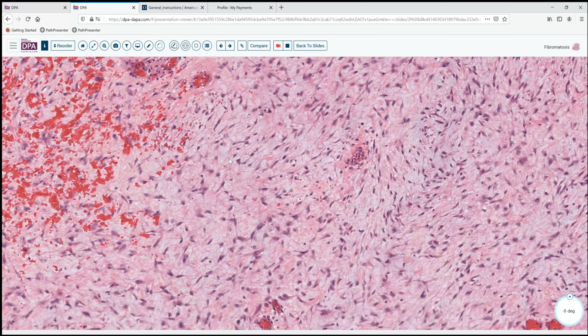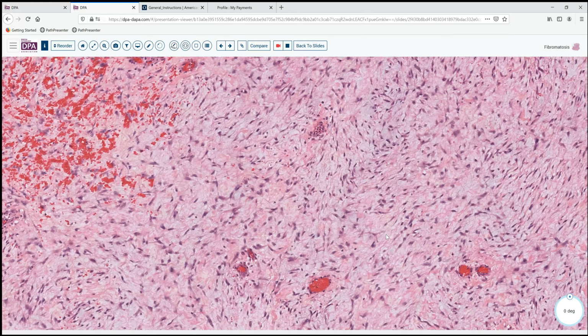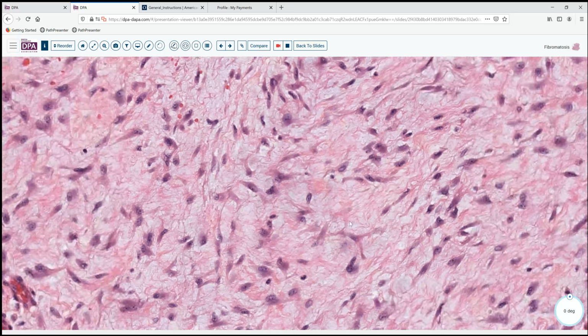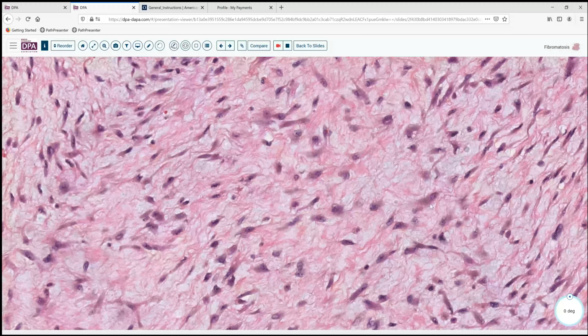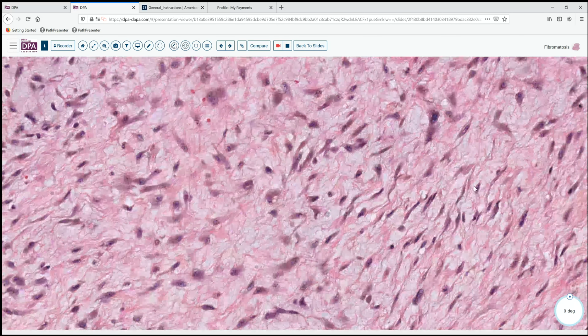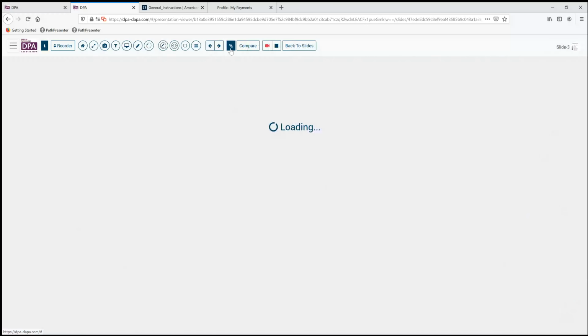but again, fairly low-grade spindle-shaped cells with no particular evident mitotic activity, a little bit of pale purplish cytoplasm on some of these cells. Sometimes more drawn out and sometimes more compressed into wavy spindle-shaped cells. And a bit of a collagenous type of background. Here we see the sort of fibrillar collagenous matrix characteristic of this lesion.